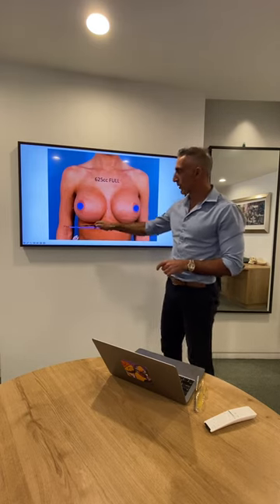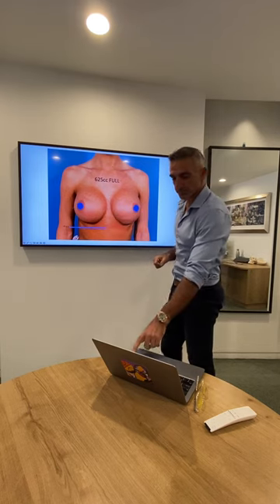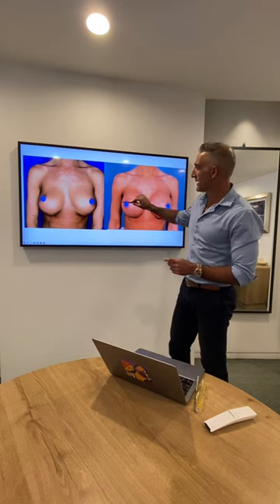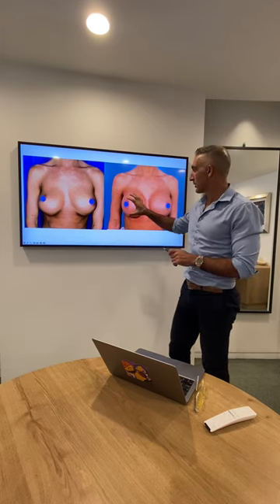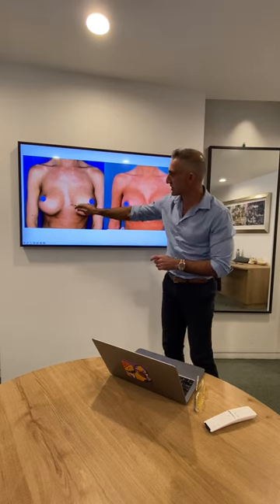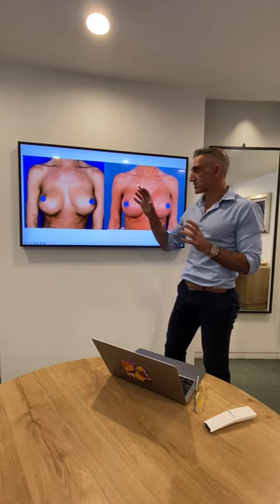Now, as you may recall, the bottom of the breast was at that tattoo line. We've lifted all that up. The nipple now looks more central on the breast mound. When we compare them side by side, you can see the difference. The nipple hasn't really changed much in height, but it now appears more central on the breast because we've lifted the breast up. We've tightened the pockets and made the cleavage much closer, because there was bottoming out and infralateral migration on that side. That's the best way to fix bottoming out — by lifting up the breast platform to match the chest platform.